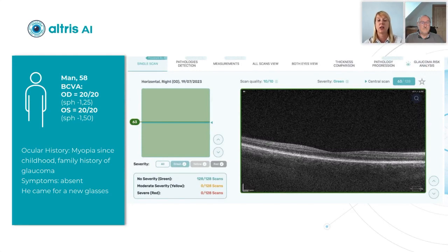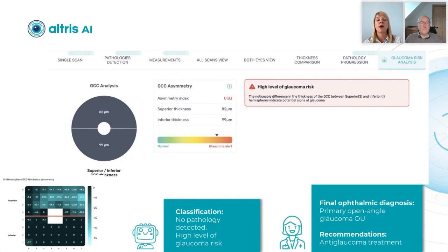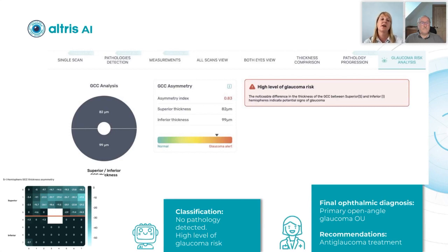Here's what you can see. Looking at the classification detected by AI, there was basically no pathology detected in this case, but a high level of glaucoma risk was identified. By analyzing the ganglion cell complex, AI detected a high risk of glaucoma in this patient.